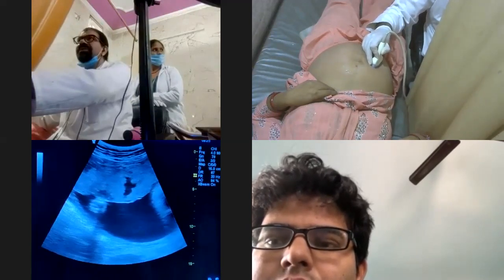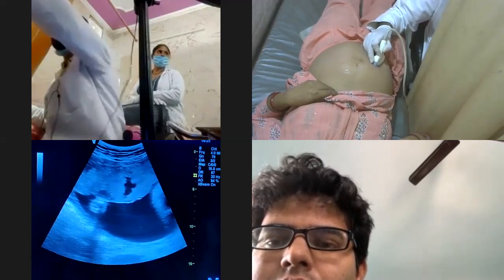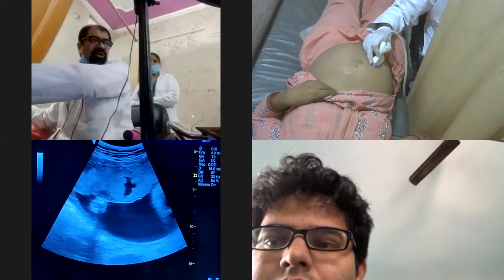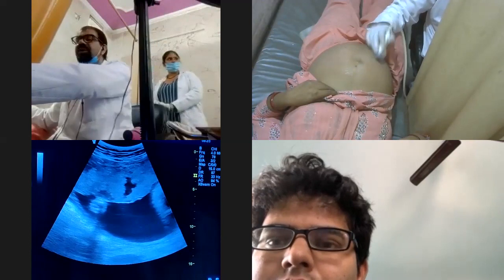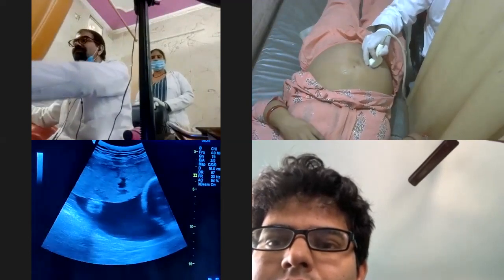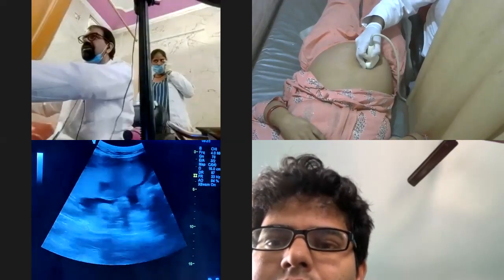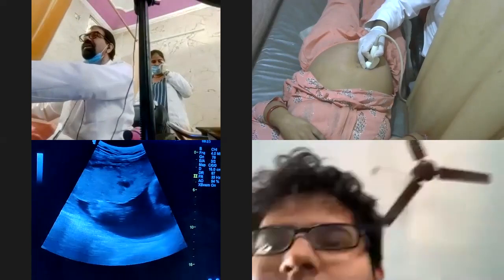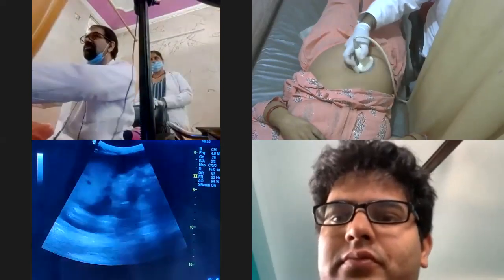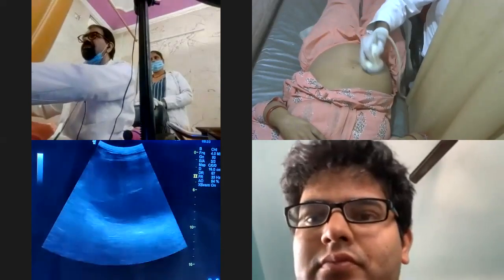For example, this is 30 weeks. If I see only one, I will not be worried. But if I see 10, 15 placental lakes, what can that be? Recall the theory. What is that, or what can that be rather. Yes, Dr. Lish? Yes, sir. What can that case be? Placenta accreta. Yes, sir.